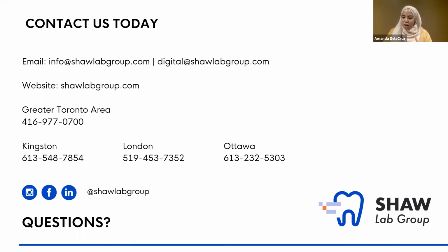One is, what troubleshooting tips do you have for intraoral impressions? As I said, we see thousands of intraoral scans in a year, so we see a lot of patterns in the scans we're getting back. It's not always relative to what scanner you have, but the process of it. When we have issues, it might be when someone is moving too quickly in the scan. Sometimes they're moving so fast it's almost like a panoramic photo, where it starts stretching. If you printed models from a fast scan and a slower scan, you'll see the arch is actually wider in the one that went too quickly. So I recommend that you slow it down.